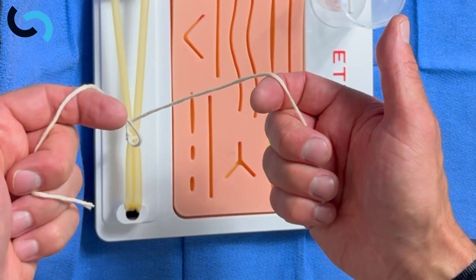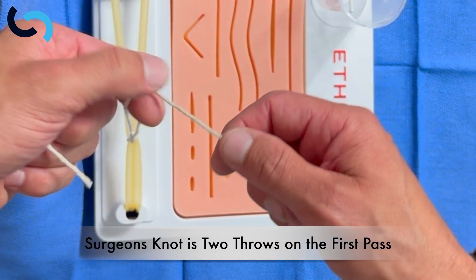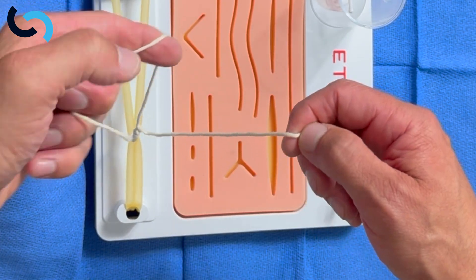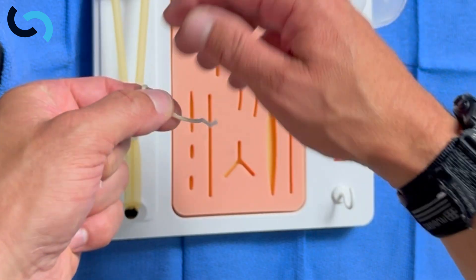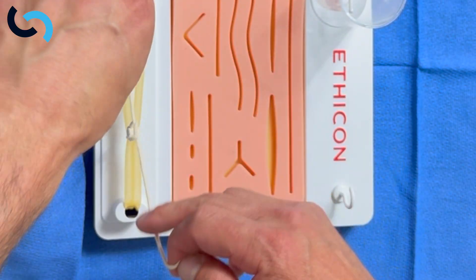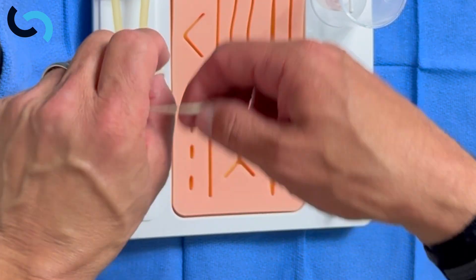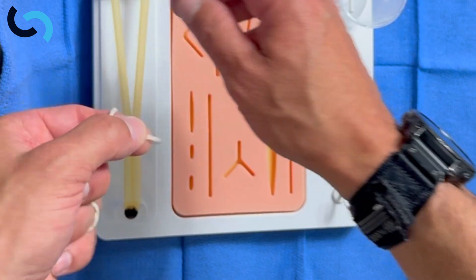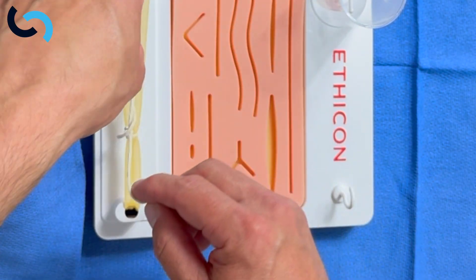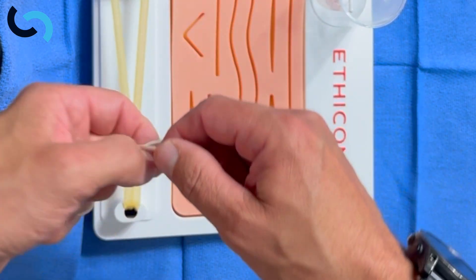What if we want to throw a surgeon's knot? We can do that by just going through twice — one, two. A surgeon's knot is just the first throw done twice, and then you follow it up with single throws, making sure that the knots are going down square by crossing your hands.